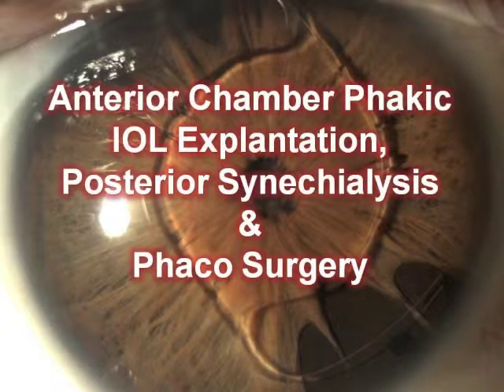Anterior chamber phakic intraocular lens explantation, posterior synechialysis, and Phaco surgery.